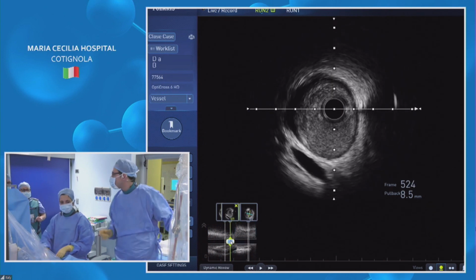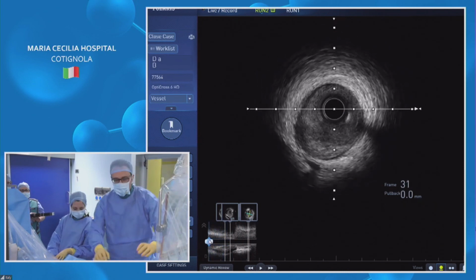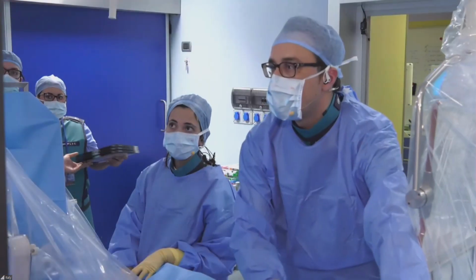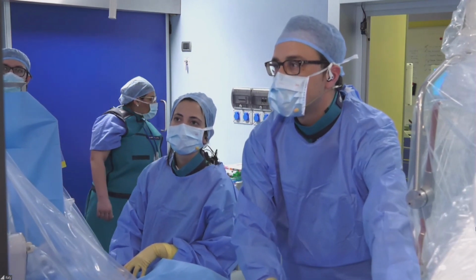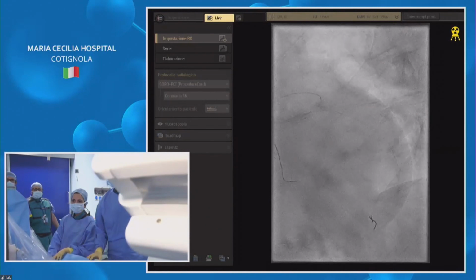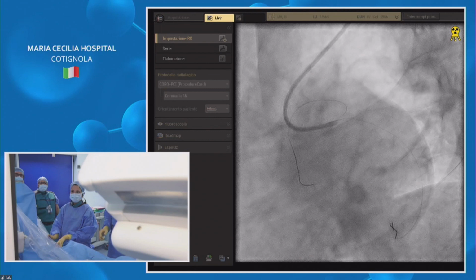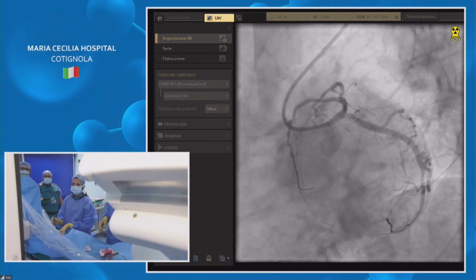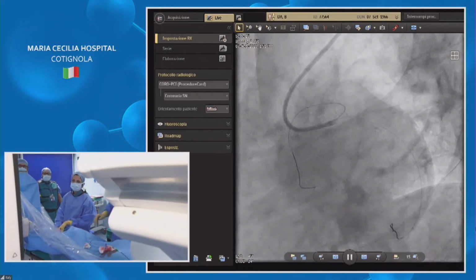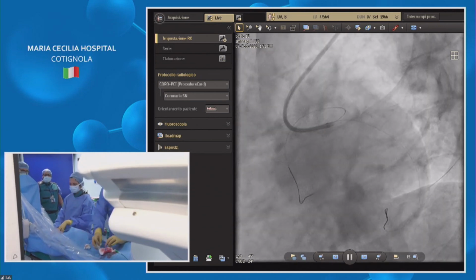Can you just show us the spider if you have one? Yeah, can we have a look again at the spider view? Okay, let's do one now. Okay, yeah, this one. Healthy. My left main looks healthy here. This is disease. What do you think?